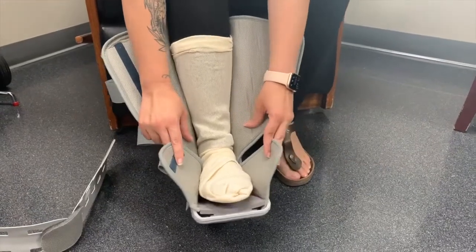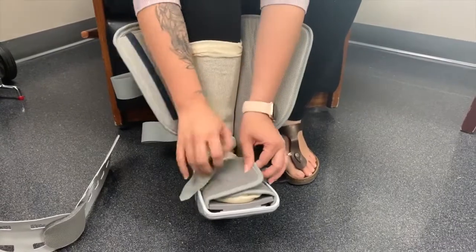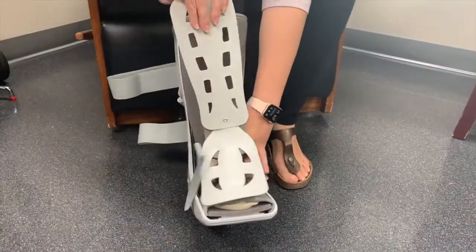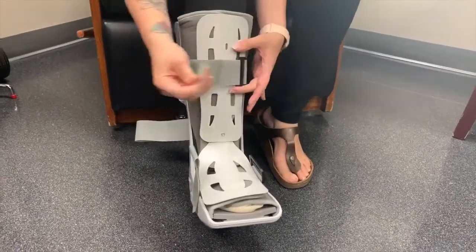To put on the boot, place your foot at the bottom and make sure your heel is all the way to the back. Close the soft covers, put on the top cover, and close each strap to comfort.